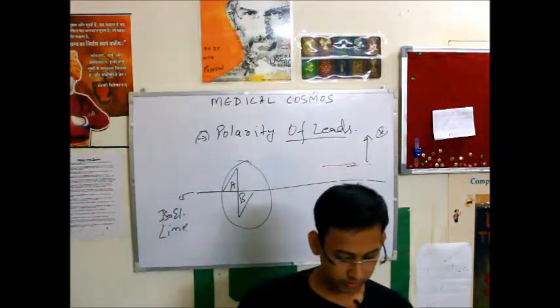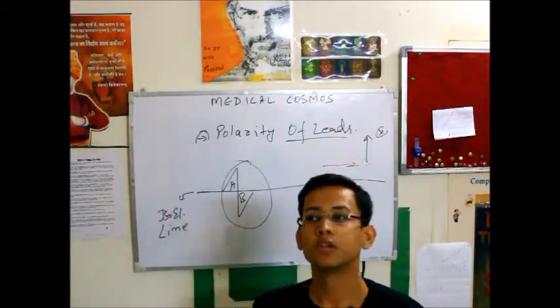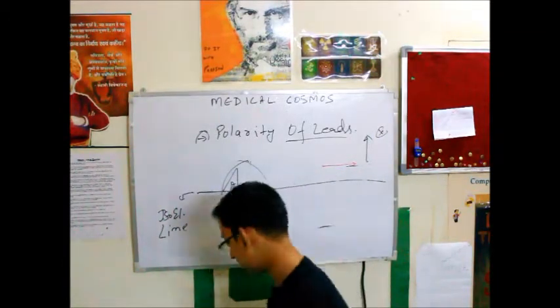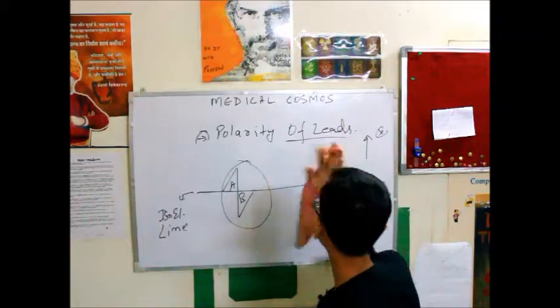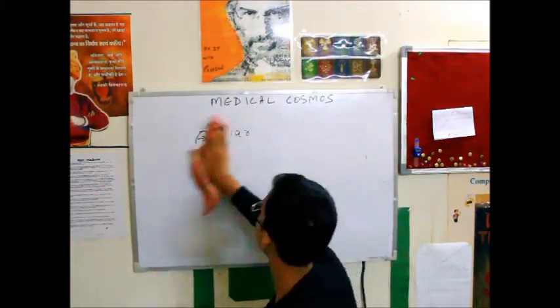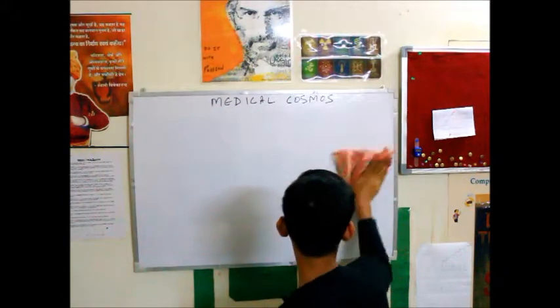First of all, you have to get real knowledge of vectorial analysis before interpreting the ECG, as ECG is very close to vectorial physics.